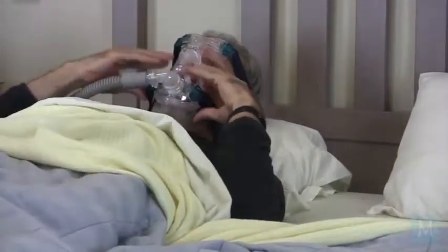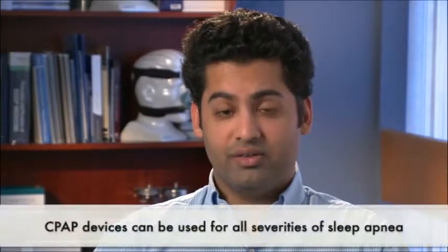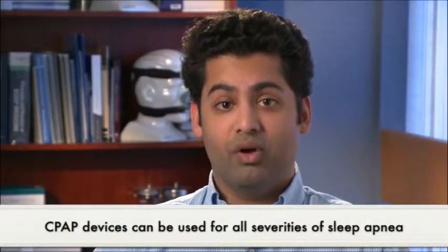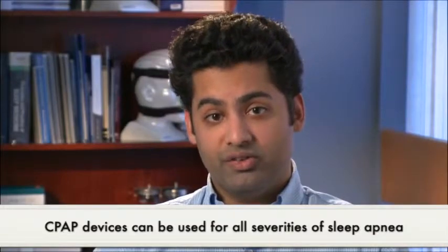And since it's something that someone needs every single day, it's more like eyeglasses in the sense that once you wear eyeglasses, you have to use them every day. It's not necessarily curing your vision, just like CPAP doesn't cure sleep apnea, but as long as you're using it, your sleep apnea is completely treated. One advantage of a positive airway pressure device is that it's able to be used by people of all severities of sleep apnea. It's really a question of figuring out what the settings of the machine are to keep that airway open at night.